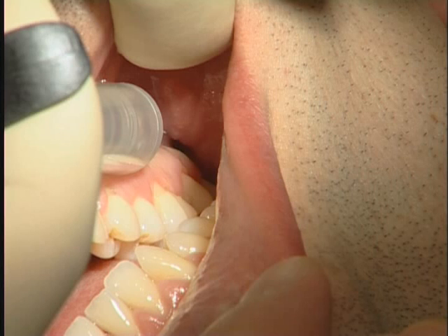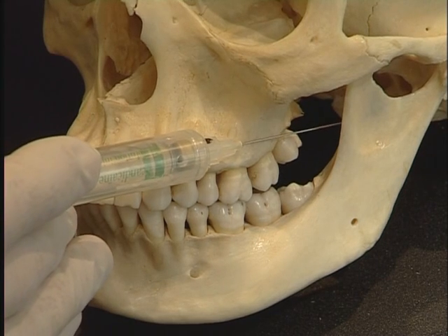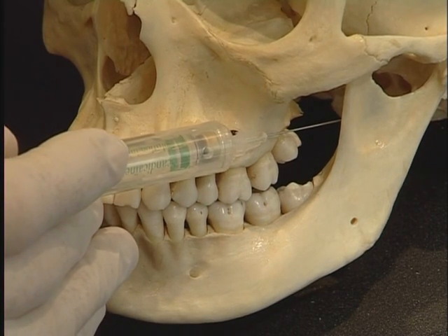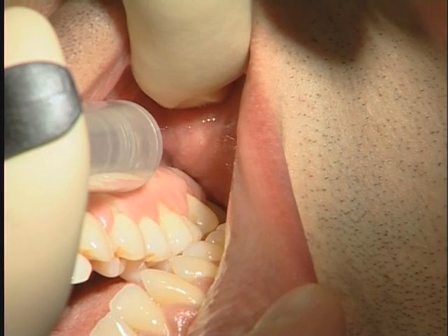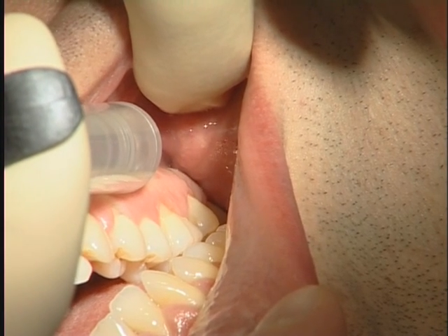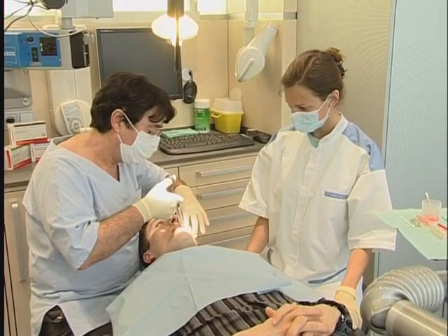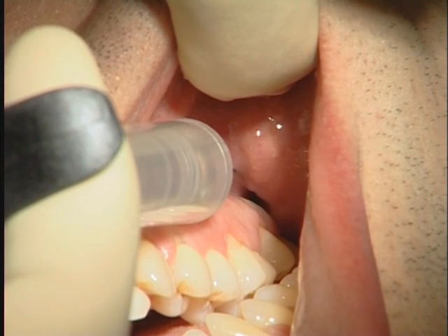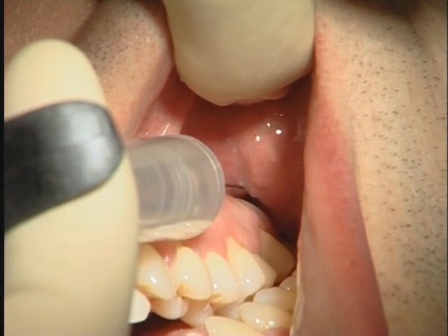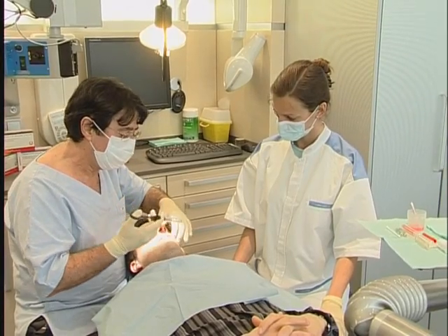zygomatic process. You can then penetrate medially to the bone coronoid process and thus the temporal muscle to a maximum depth of 20 mm painlessly and without resistance, but ensure that you remain in contact with and at all times tangent to the maxillary bone. Aspirate and then inject the contents of the cartridge slowly. This technique can be a bit disconcerting at first, as the tip of the needle never comes in contact with the mandibular bone.